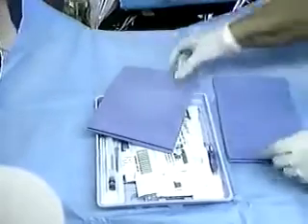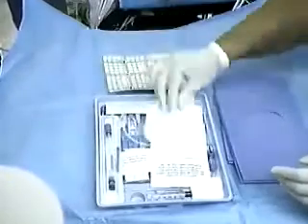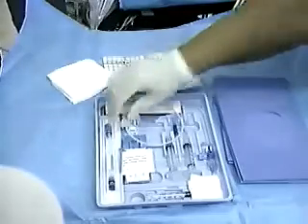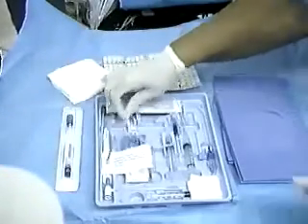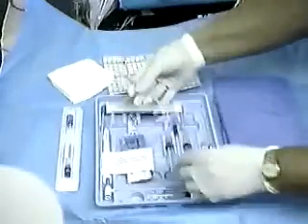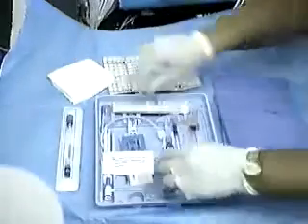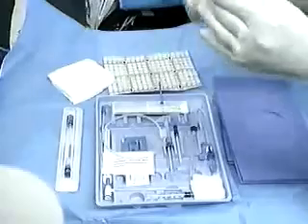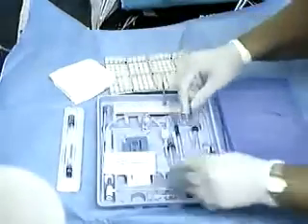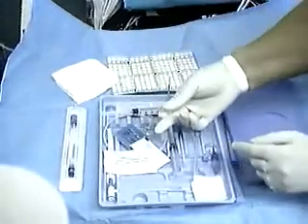The contents of the equipment tray include sterile drapes, sterile gauze, a flexible guide wire contained within a sheath, an introducer needle attached to a syringe, local anesthetic, and a smaller needle and syringe used to inject local anesthesia.